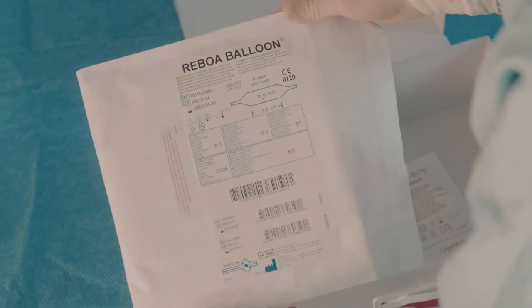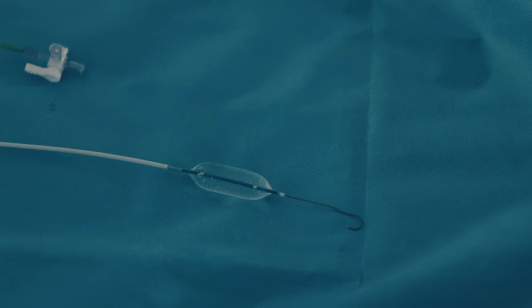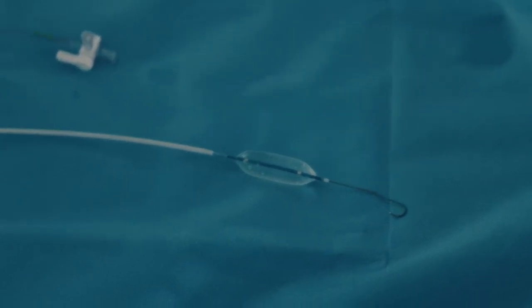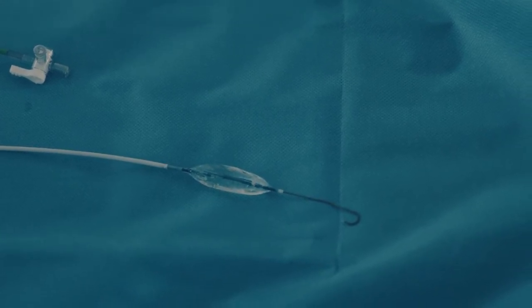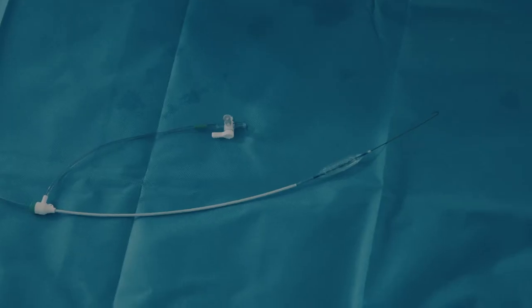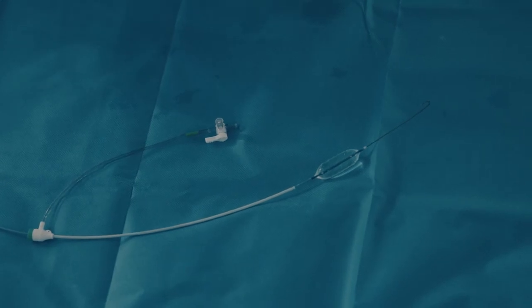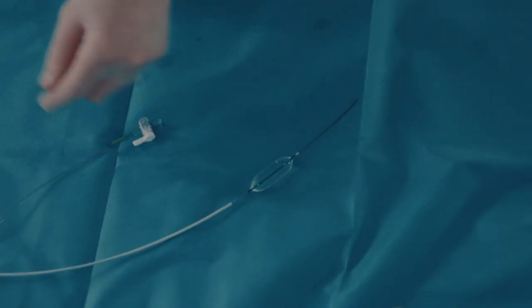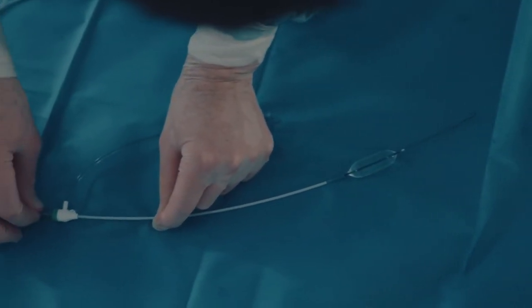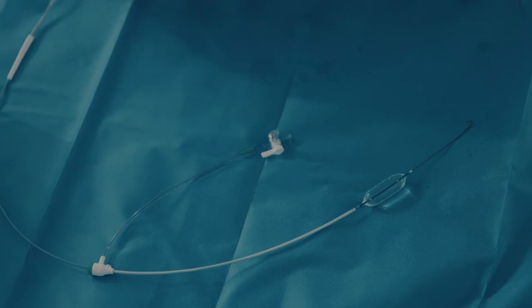Identify the fixation suture and the Reboa Balloon Catheter packed separately on the bottom of the kit box. Make sure that the balloon has the desired size. A balloon with a 15mm diameter is recommended for use in aortic zone 3. For zone 1, either a 15 or 20mm balloon is recommended. The Reboa Balloon consists of a non-compliant balloon which does not allow the balloon to be inflated to a larger diameter than indicated on the label. This reduces the risk for overstretching and rupture of the aorta. If the balloon is filled with more fluid than indicated in the IFU, the balloon will rupture alongside the shaft to avoid damage to the aortic wall.